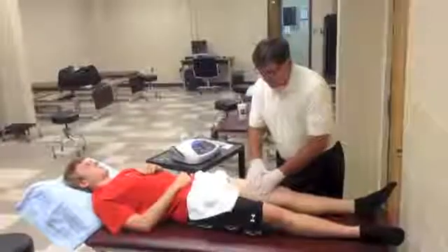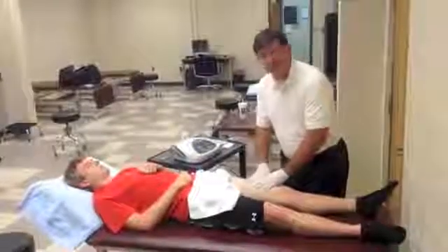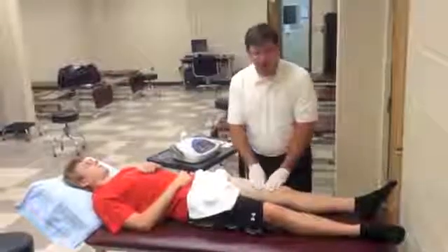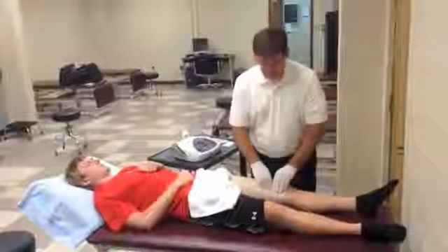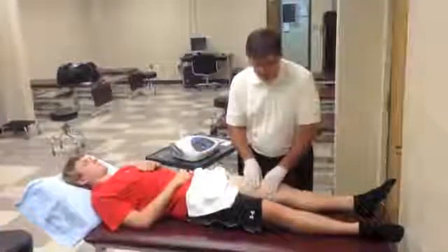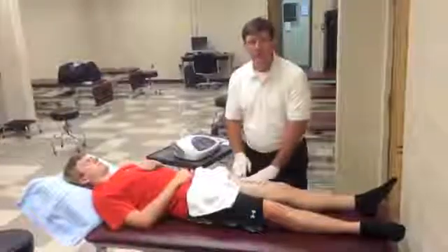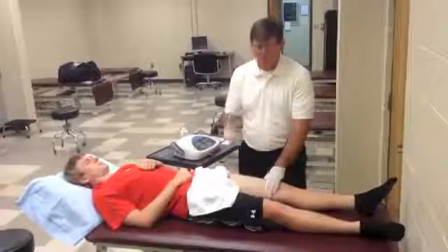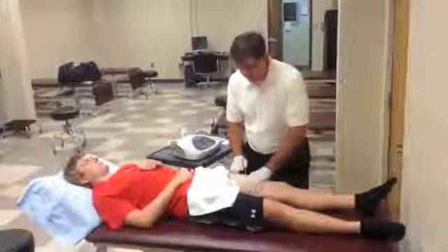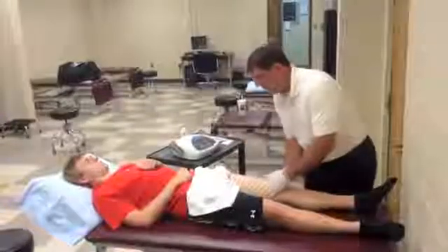Since this patient is subacute, we're using a mid-range of frequencies. If the patient were acute we would probably want to use a very high frequency, and if he's more chronic we would use a more low and thumping type of delivery of the energy.